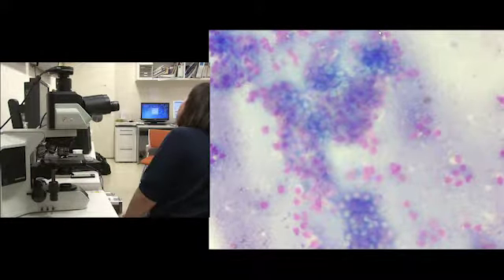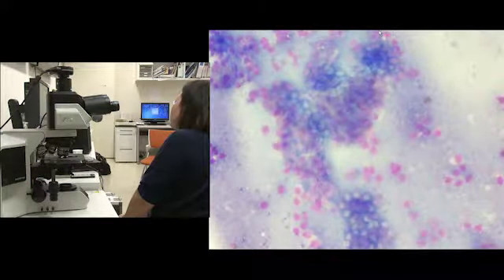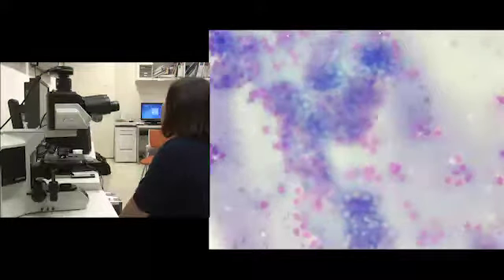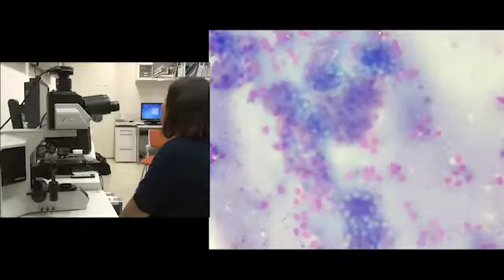Okay. I raised the question if this could be a lymphoma as well, but she suggested to look at the slide in detail. We have some core material from there. So we'll wait for histology for the core specimen. To confess, a small bleeding happened after the FNA. So we wanted to do more sampling, but safety for the patient is the best interest. We have a good material, so we decided to just wait and see what the pathology shows, and we can add more FNA in the future if needed.